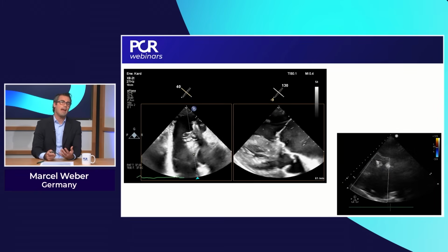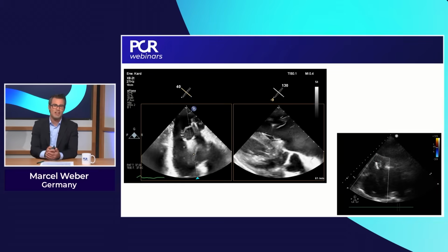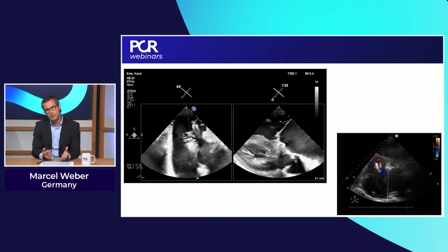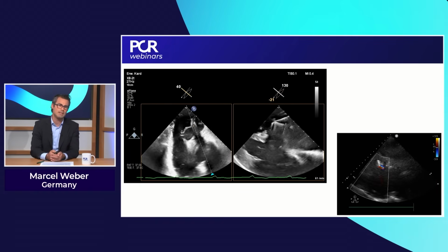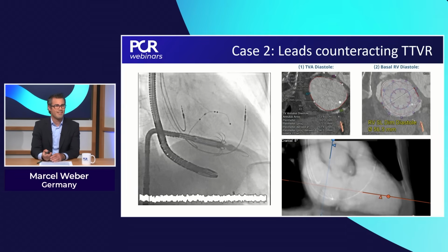And this is the anatomic result on the left-hand side, and the discharge echo on the right-hand side. So I think it's a very good result in this difficult case, and we had no problems with the lead at all. So, yeah. Marcel, thank you.